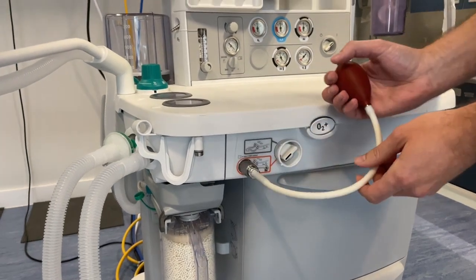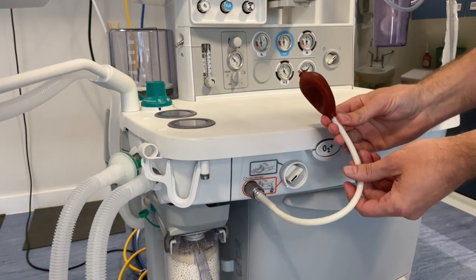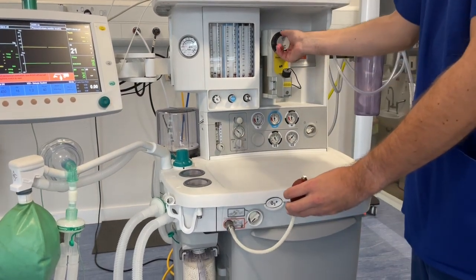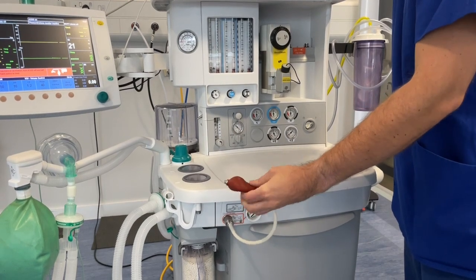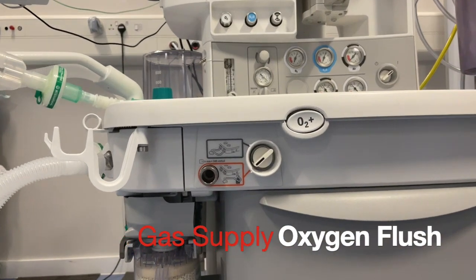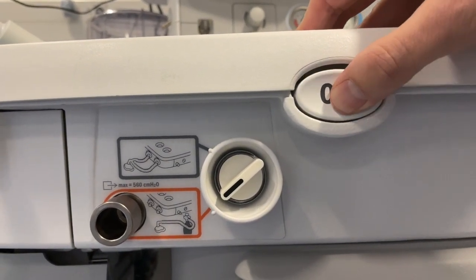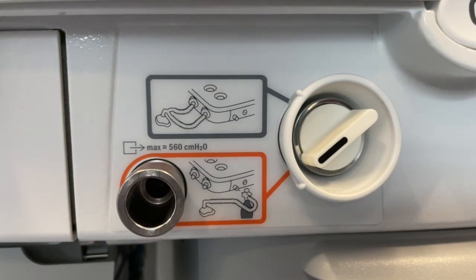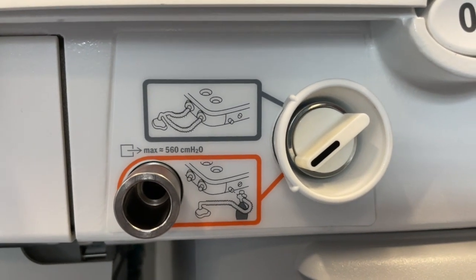Connect the test bulb to the gas outlet and squeeze to remove the air. If it remains deflated there are no leaks in the system. Leaks in the vaporizers can be tested in exactly the same way — ensure that the test is repeated for each of the vaporizers on the back bar. Once the outlet is engaged you can test the emergency oxygen flush. When the test is finished it's imperative that the switch is returned to its original position to avoid any adverse incidents.